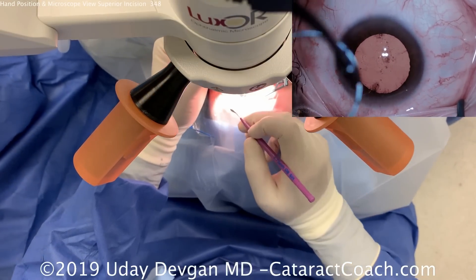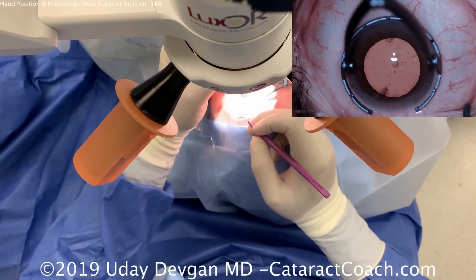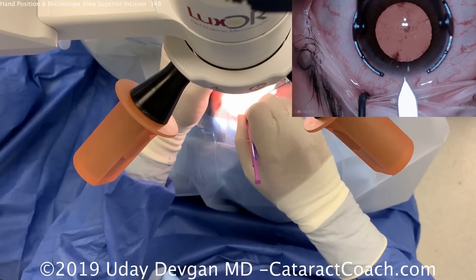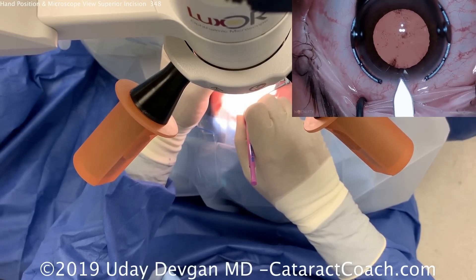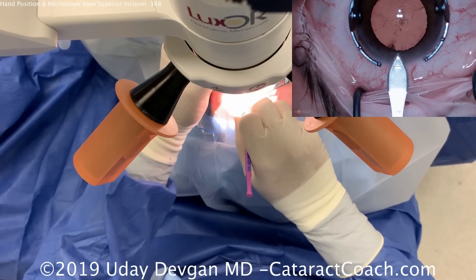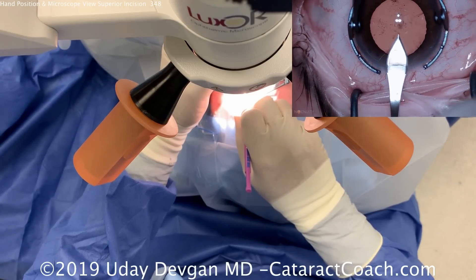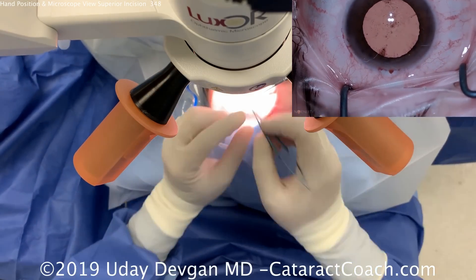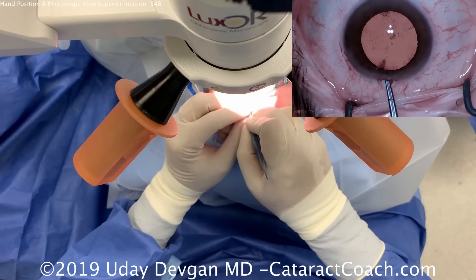Now with the fixation ring in the left hand and the keratome in the right hand, we're going to make that superior incision right there at about 12 o'clock — the eye has already been marked. We want an incision that's not too long, to achieve astigmatic flattening at that meridian. At the end of this case, we'll make a paired full-thickness incision opposite that at 6 o'clock.